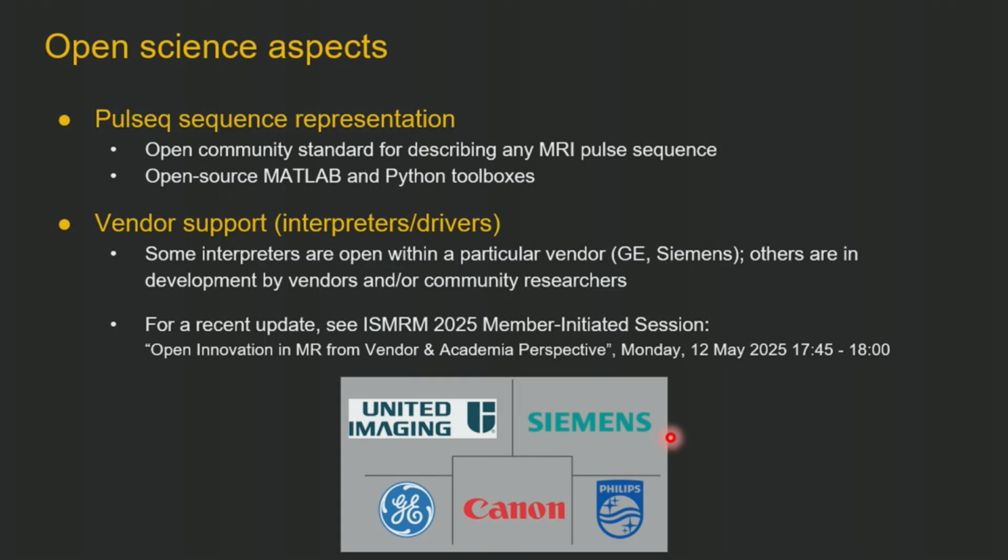Okay, so hopefully trying to emphasize the open science aspects here. Again, PulseSeq is an open standard for defining your sequence. It lets you use open source tools such as MATLAB or Python to both design and analyze your sequence.